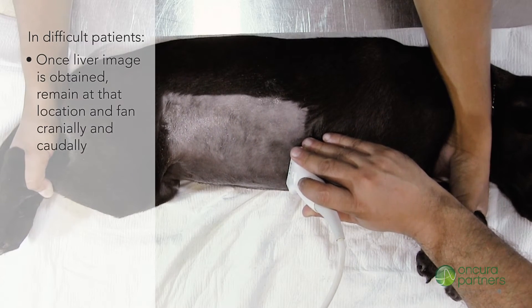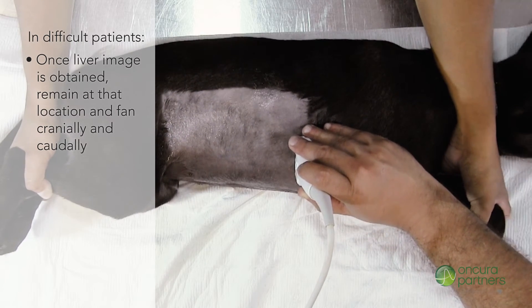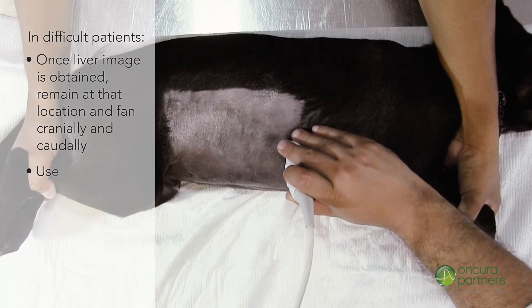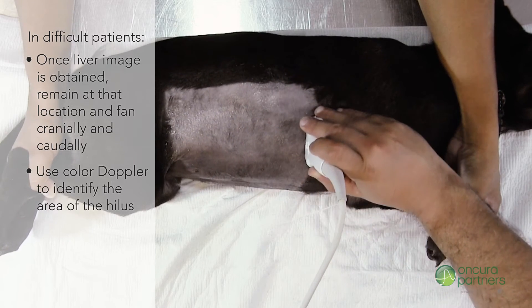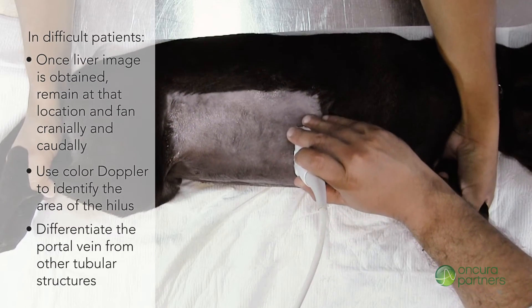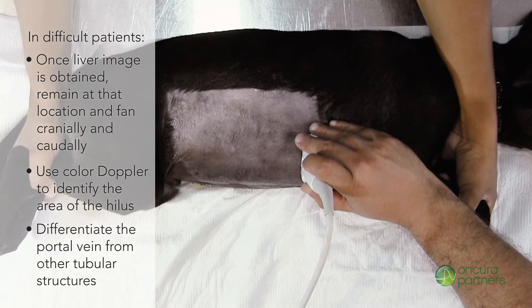Once an adequate image of the liver is obtained, the sonographer should remain at that location fanning cranially and caudally. Use color Doppler to identify the area of the hilus and differentiate the portal vein from other anechoic tubular structures such as the common bile duct. Adjust your color Doppler settings as necessary.